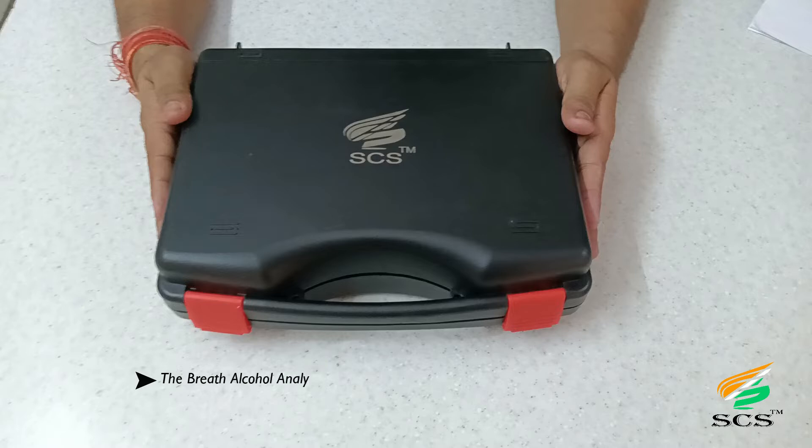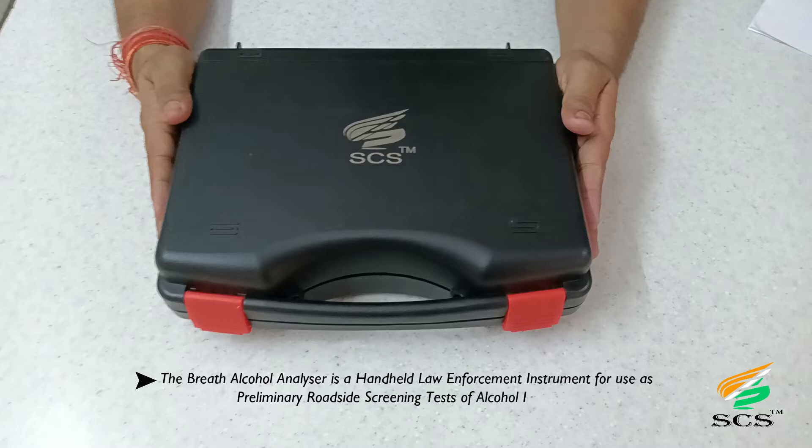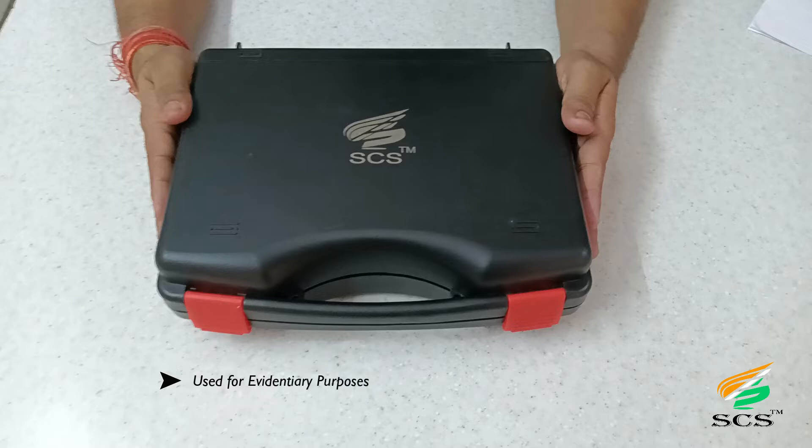The Sanchar Breath Alcohol Analyzer is a handheld law enforcement instrument for use as a preliminary roadside screening test of alcohol influence, used for evidentiary purposes. The results are used for prosecuting traffic offenders.